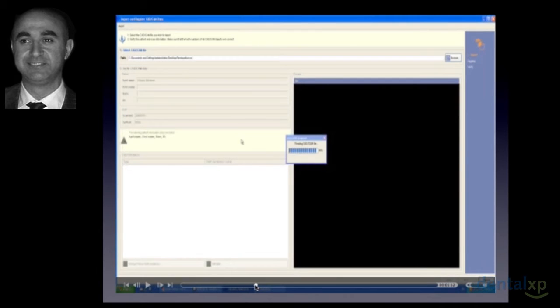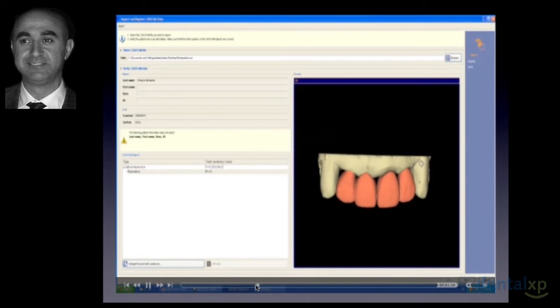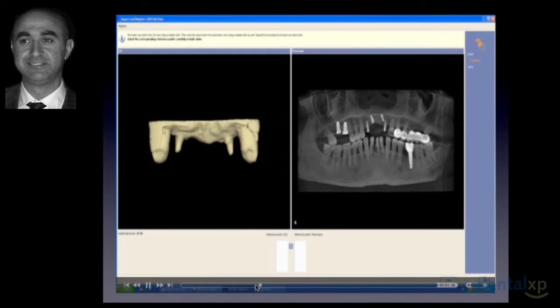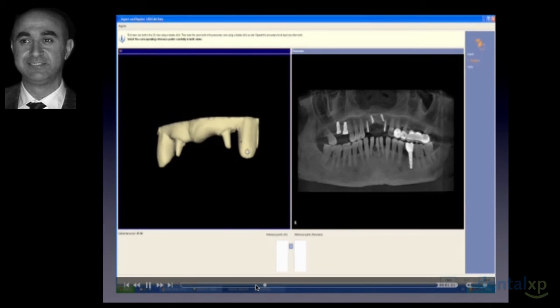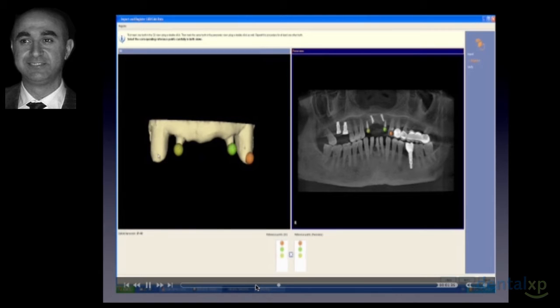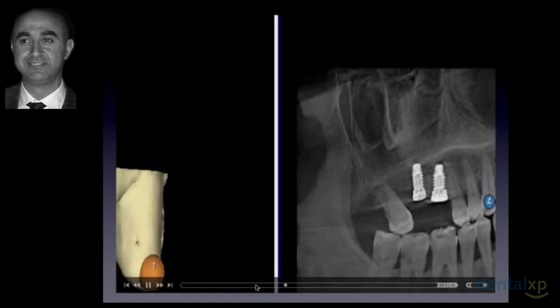And if we move a little bit across, the good thing is with the optical impression from the CEREC machine, we can actually construct or virtually plan the 4-unit anticipated bridge or restoration, and we can overlap this optical impression on the cone beam CT by matching these 4 points, by placing points on each tooth which resembles the optical impression on the CT itself.